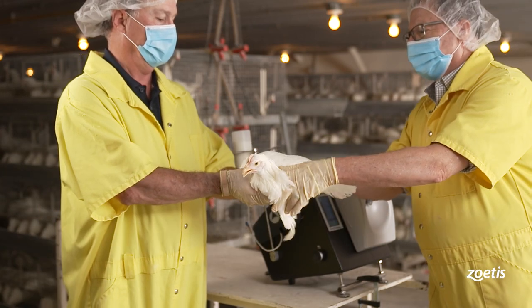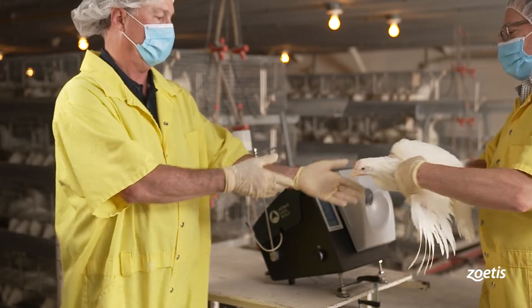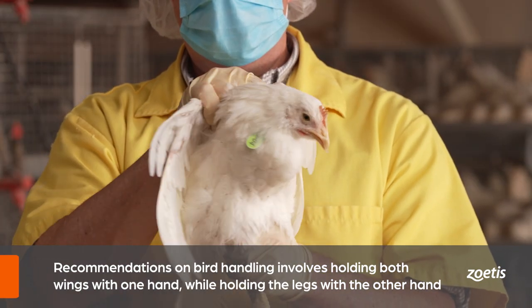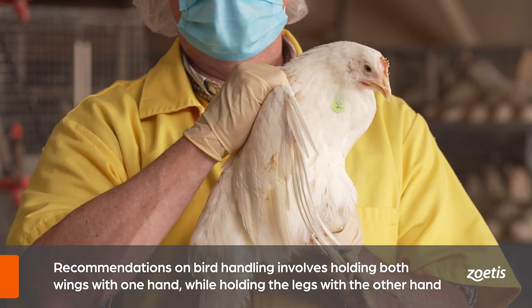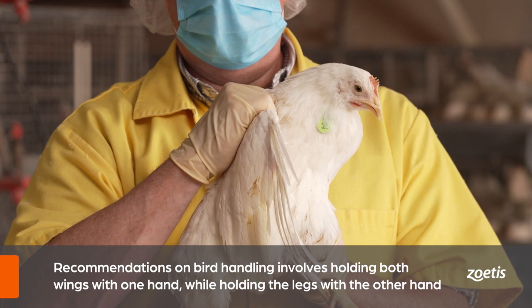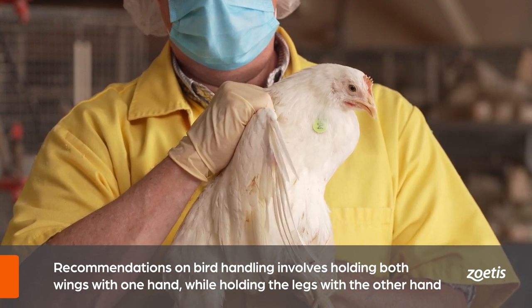The bird collector will hand the bird to the operator, who will be stationed near the DBV. When positioning the bird, use one hand to hold both wings with the breast facing away, and the other hand to hold and stabilize the legs. This should be done securely but gently, and birds should remain calm and comfortable.